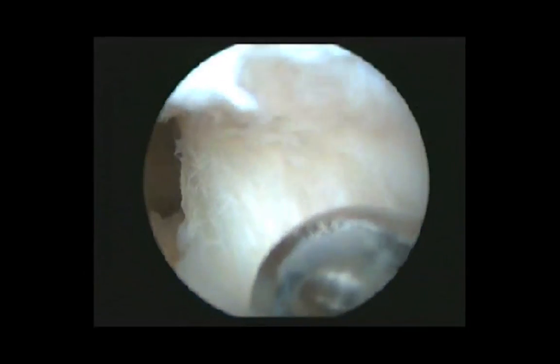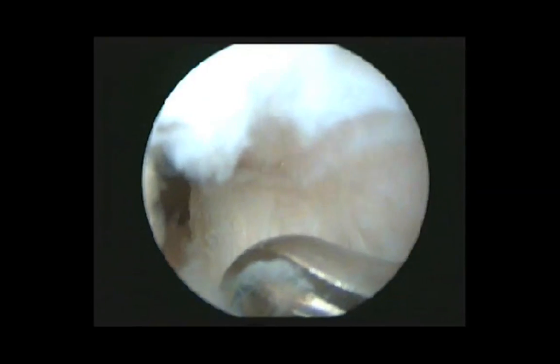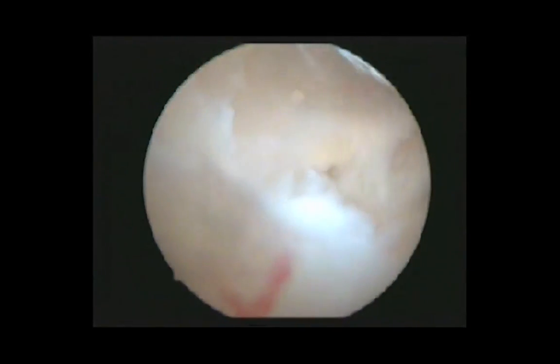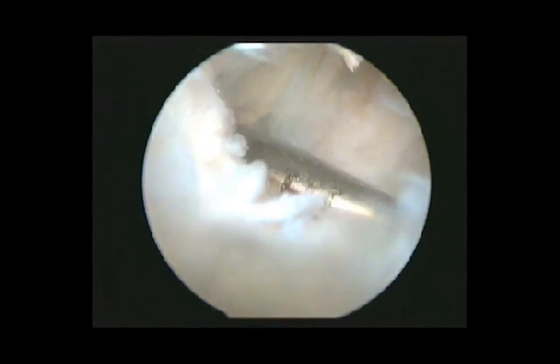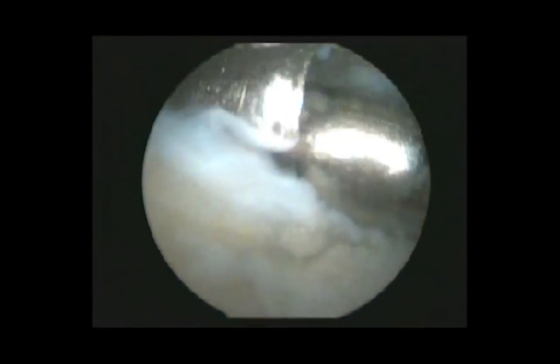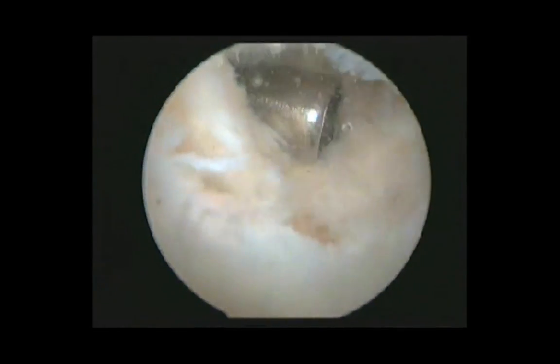This minimizes the chances of injury to the ACL or PCL. As you can notice here, the ACL is almost intact after creating a portal. Through this portal, we pass a scope into the posterior compartment. In the process of creating a posterior medial portal, we press the skin outside to confirm it is exactly over the desired spot, and then a Visinger rod is passed from out to in, over which a 5 mm cannula is inserted.